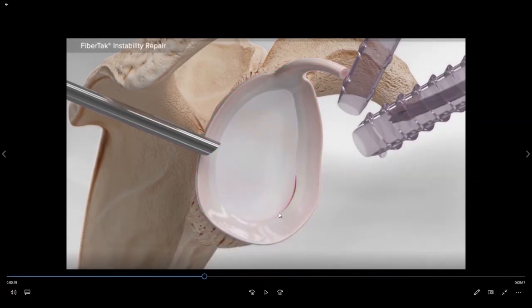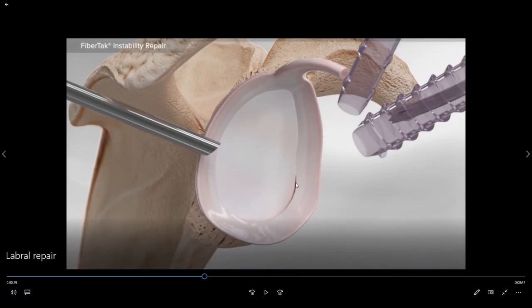So in order to perform an arthroscopic labral repair we will initially roughen up the bone on the under surface of this torn labrum so as to create bleeding that will then help to stimulate the healing of the labrum back down to the bone.